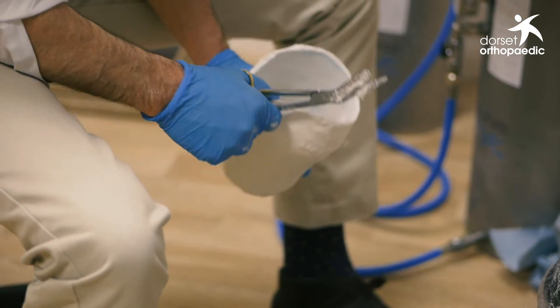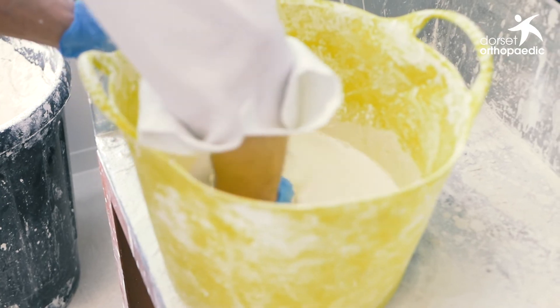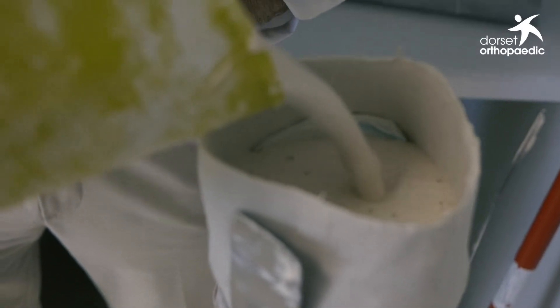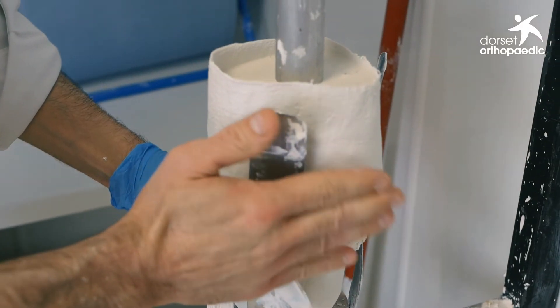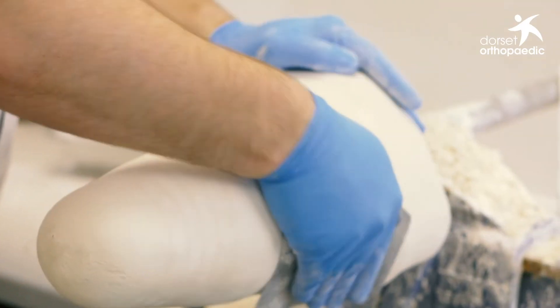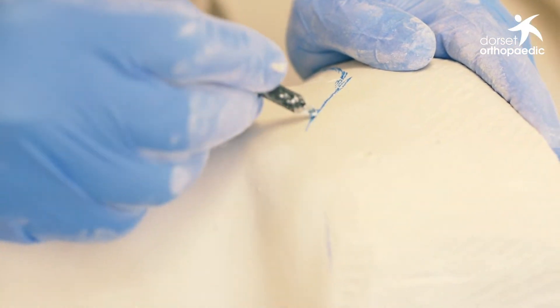Once we've taken the cast, we fill it with liquid plaster of Paris as we would after any prosthetic cast and then rectify it. Because of the way the AquaSymphony system has applied pressure to the patient's residual limb throughout the casting stage, the rectification process is much shorter and quicker than it would otherwise be, meaning we can turn around a cast to diagnostic fitting within just a couple of hours.